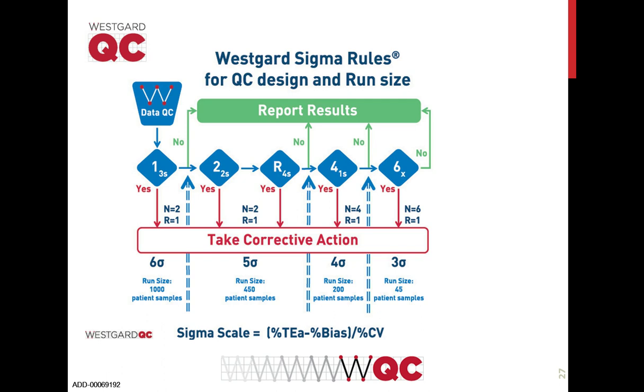And below 3 sigma, remember 3 sigma being the minimum level of quality that we think is appropriate, below 3 sigma, the Westgard rules can't help you. You will need all the Westgard rules, but you will also need to add non-statistical QC. You'll need to do much more additional techniques, maybe Bull's algorithm, maybe more frequent monitoring or more frequent calibration, something to help keep that method under proper monitoring and well observed.